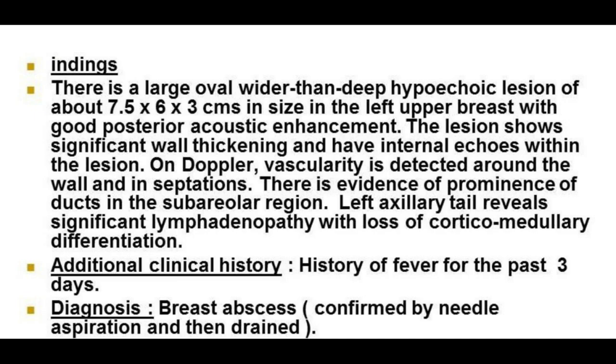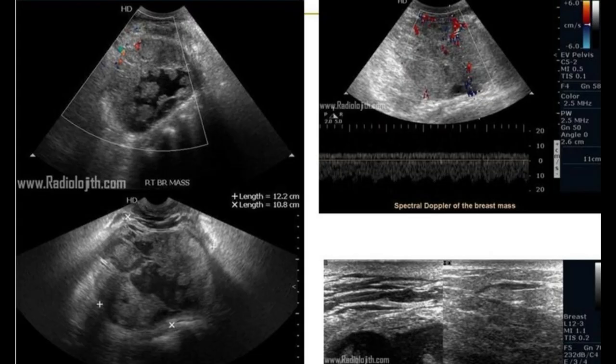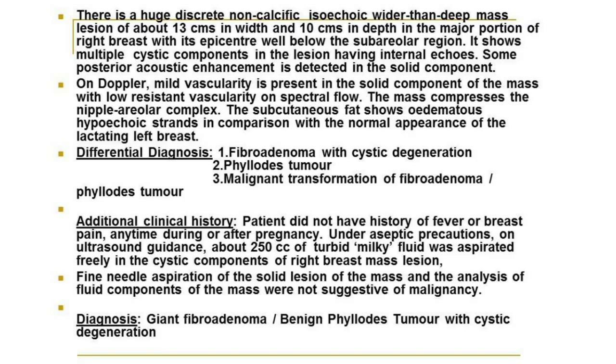The second picture reveals a huge discrete non-calcific isoechoic, wider-than-deep mass lesion with multiple cystic components. The cystic lesion has internal echoes. Posterior acoustic enhancement can be seen beneath the solid component. On Doppler, mild vascularity is detected in the solid component of the mass with very low resistant vascularity on spectral flow.